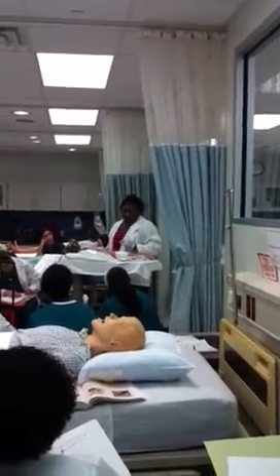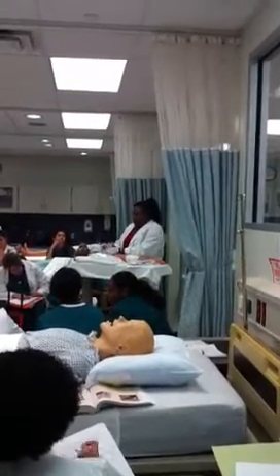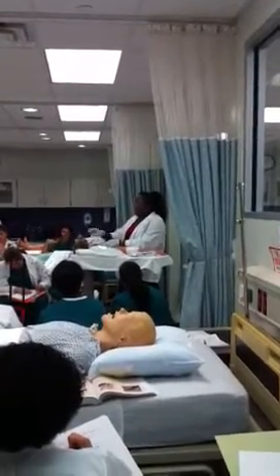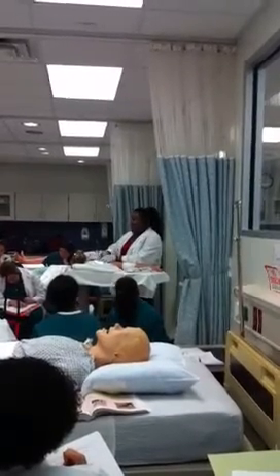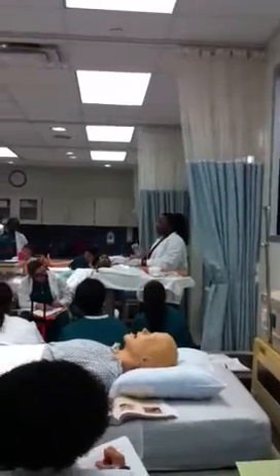Find my site. All right, Ms. Smith, I'm going to give you your injection now. Okay? Circular motion from the insertion side outward, just like when you're cleaning a wound. You're cleaning from inside out, right? Put my alcohol swab right there.